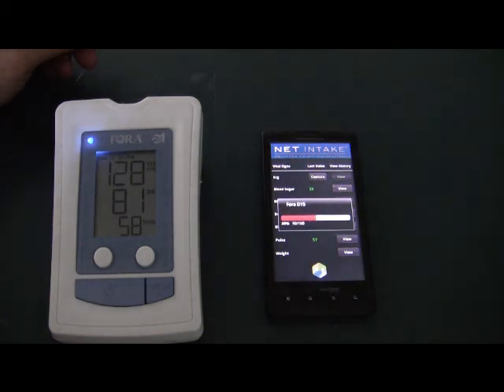Connected to BP glucometer combo. Measurement declared. Measurement stored.